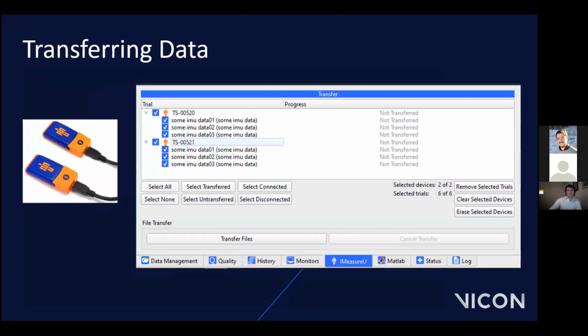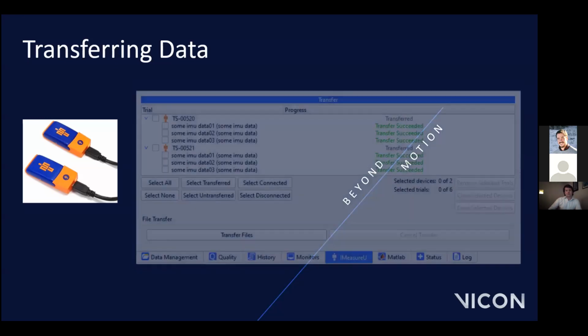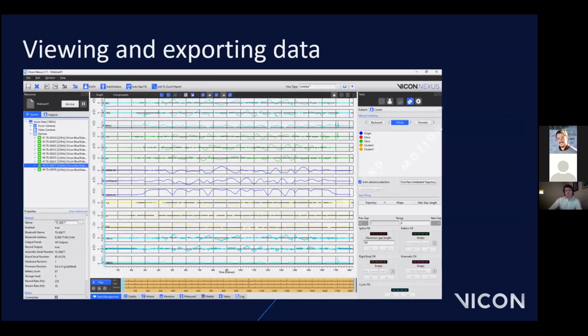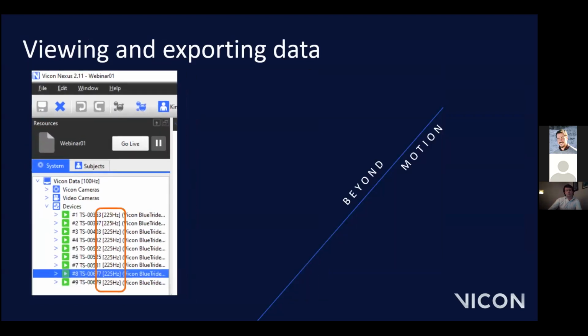After you've captured the required data, you need to download the data off the sensors onto your PC. To do this, first connect your sensors to the PC using the USB adapters. The trials will be visible in the IMeasureU window, and you can transfer the files just by clicking transfer. You may need to repeat this process depending on how many sensors you can connect to the PC simultaneously. You can then open up the trials and view the data in full. You'll also notice that the sensor frequency is reported as per the sensor capture rate and not the stream rate.